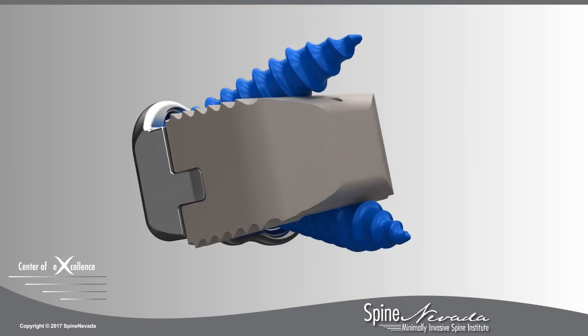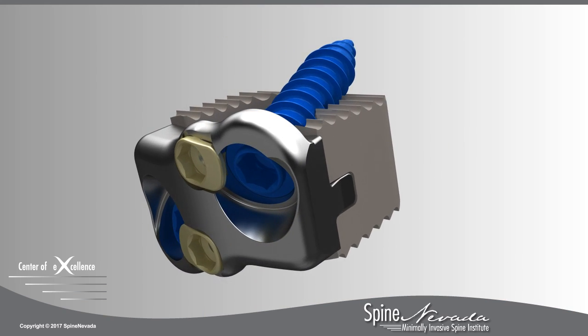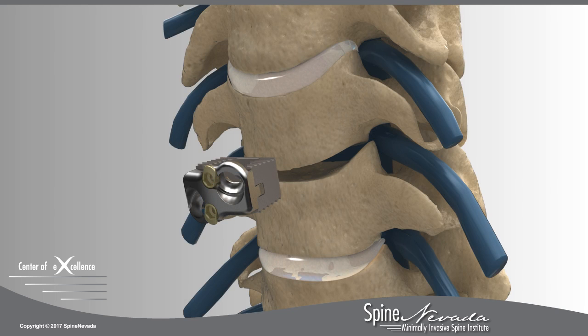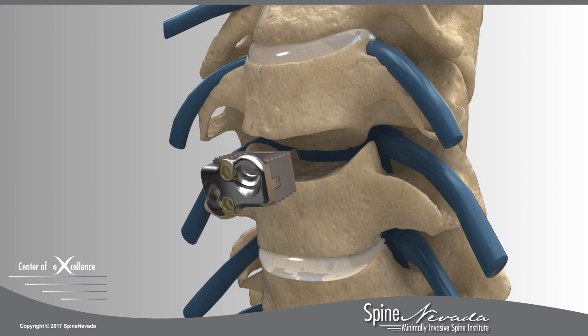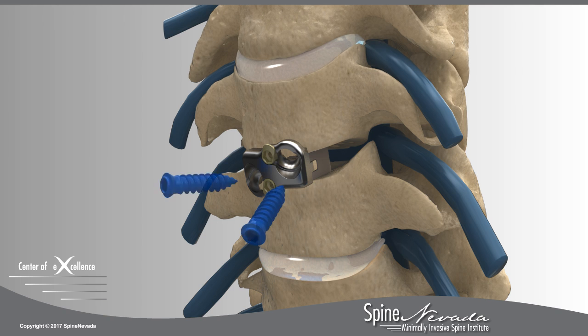The Series C standalone interbody is a special low-profile implant used to replace the damaged disc. A wedge-shaped cage, called a PEEK spacer, is loaded with local bone graft material and positioned in the open space between the vertebrae. Each screw is carefully inserted at a biased angle into the low-profile titanium plate. Cam locks are then rotated to lock the screws, securing the implant and stabilizing the spine as it heals.